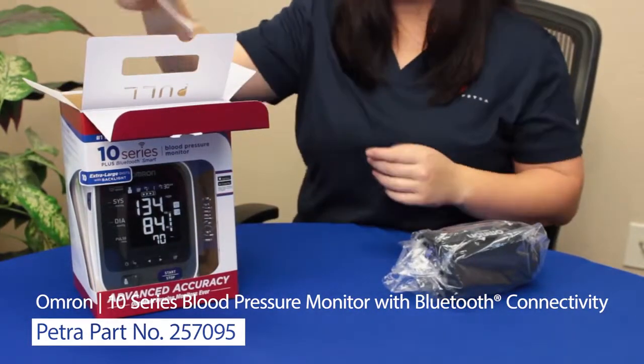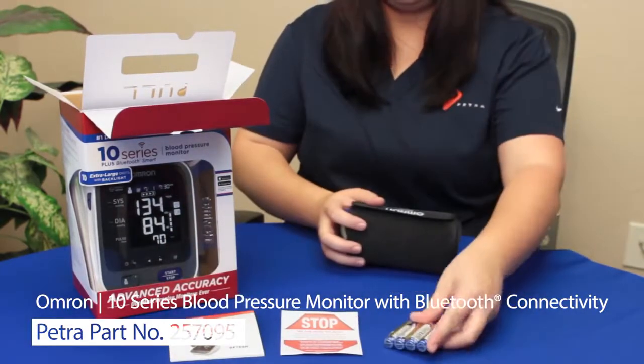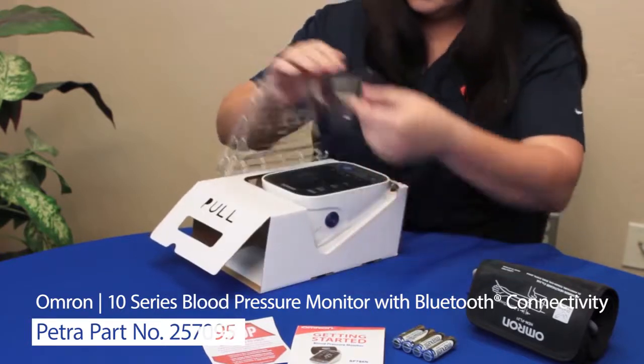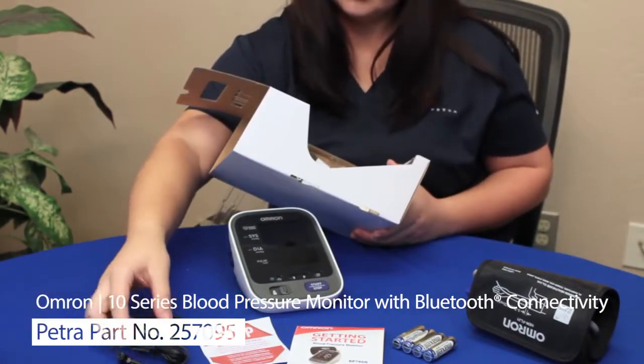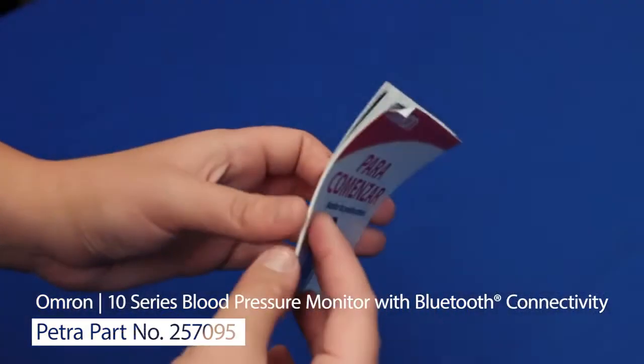The way everything is packaged inside the box is just as consumer-friendly as the outside. Opening the top reveals the rolled-up cuff and the quick start guide. Inside the cuff are the batteries. The middle part opens from the side and contains the monitor — notice how the bottom is flat but the face is angled for ease of use.